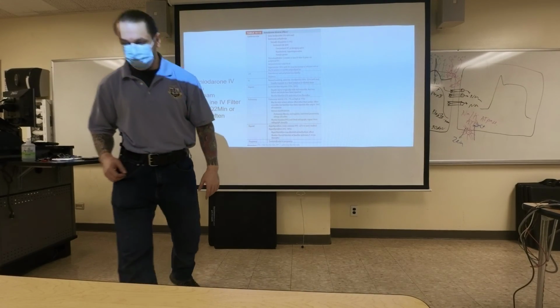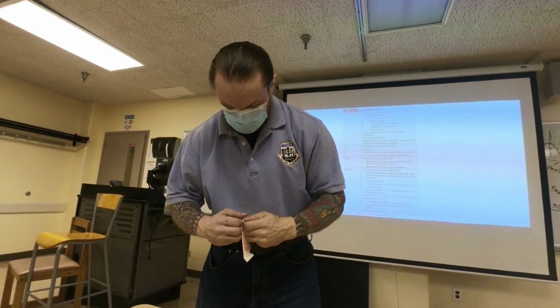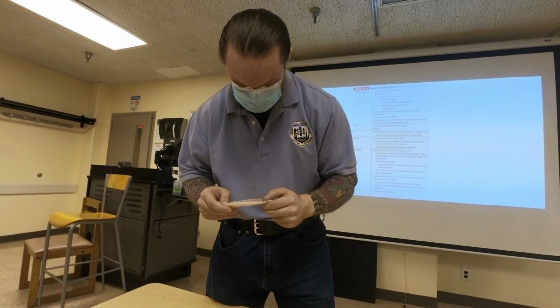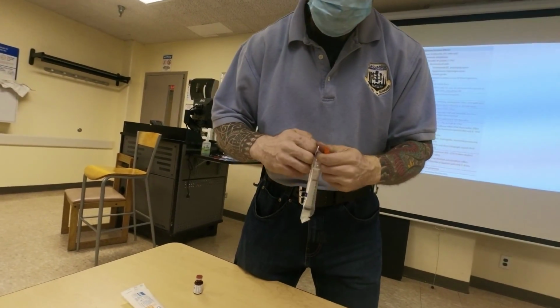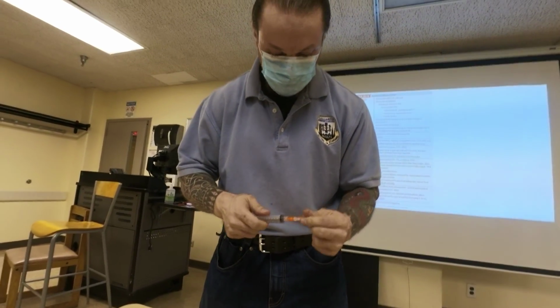And the other common one, can you grab it so you can see? So this is amiodarone, this is a bag, this is not a D5W, this is normal saline. I just want to show you what happens if you have the following situation. So you're going to mix it when you do this administration. I'm not wearing gloves, you definitely should. And you definitely should clean all your ports. I'm showing this not for how to properly inject. I'm showing you something that is going to happen if you don't do this right.